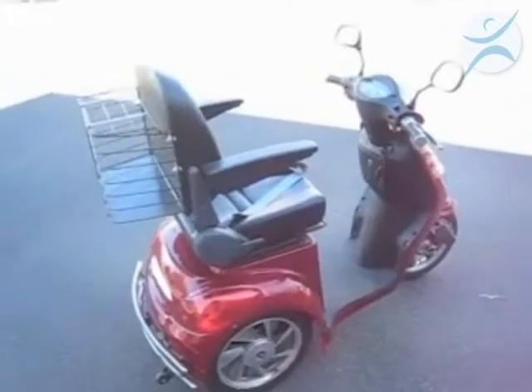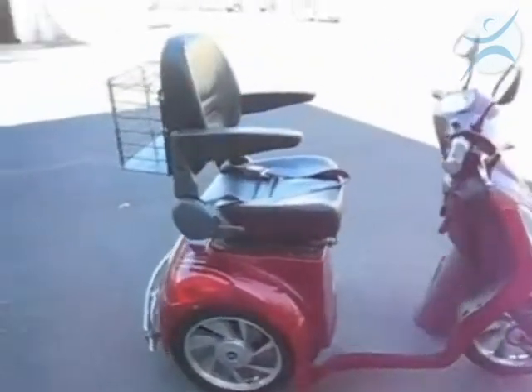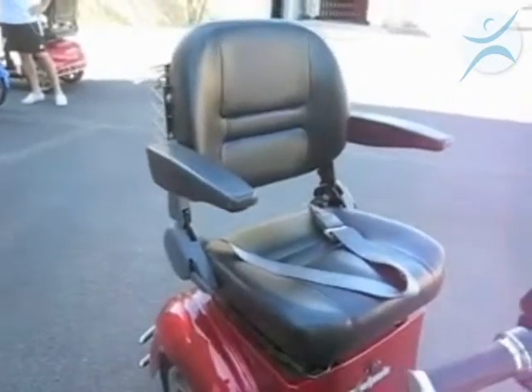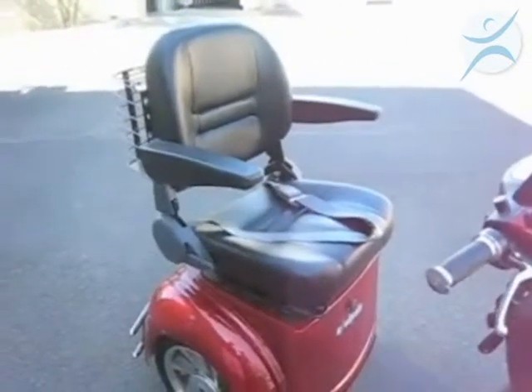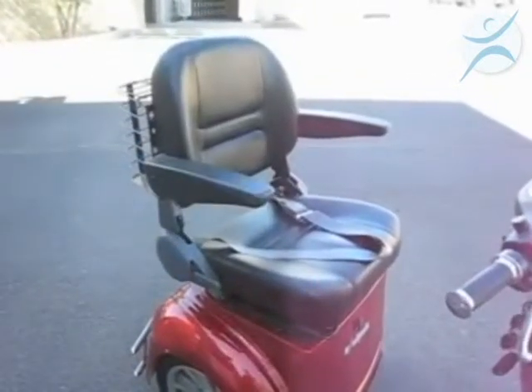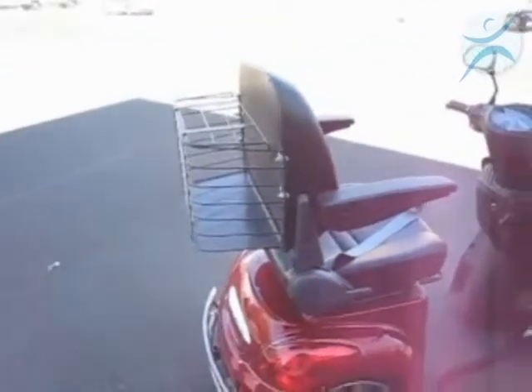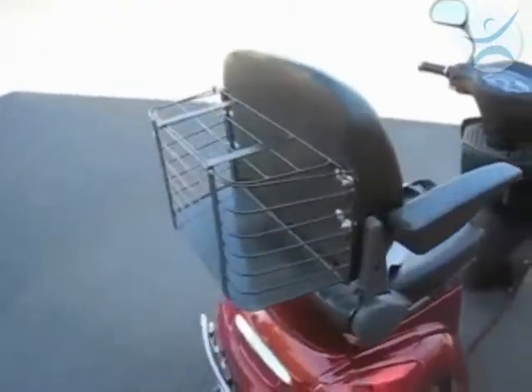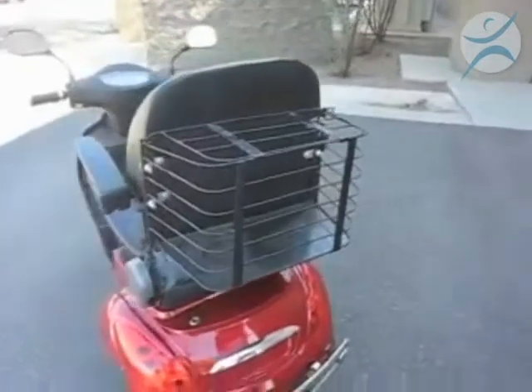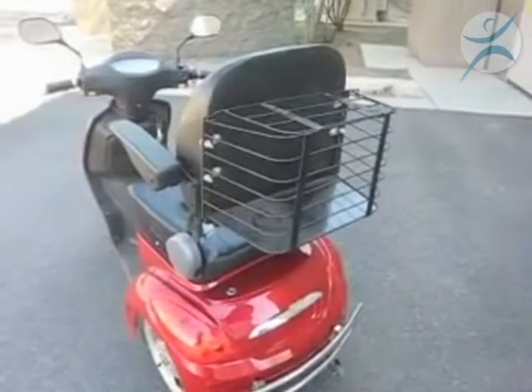This is a three-wheel mobility scooter. The seat is a very comfortable deluxe seat. The seat moves forward and back, the back of the seat tilts, and the armrests fold up and go up and down. On the back of the seat is a nice storage basket. The storage basket is held on by four bolts, and it easily bolts off — so if you need more storage, you can replace it with just about anything.